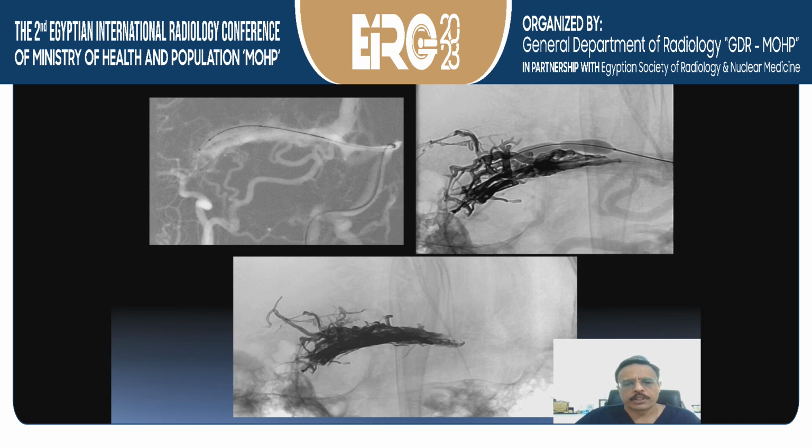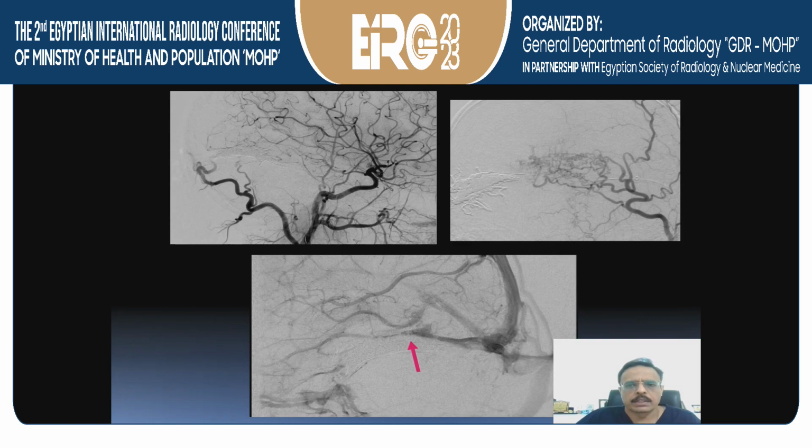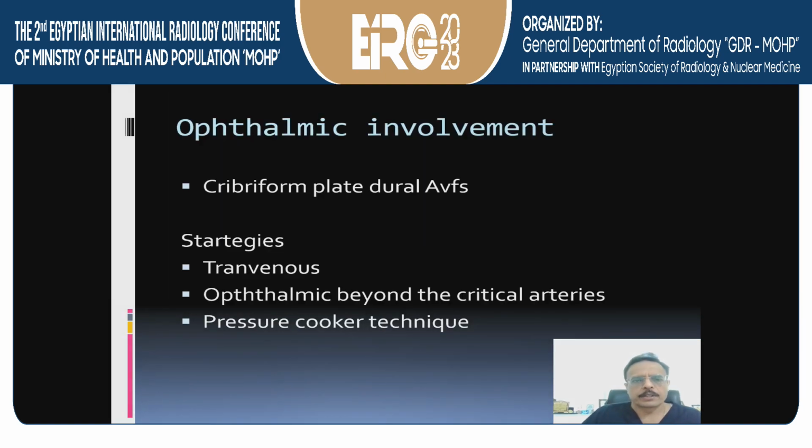But we knew the inflated balloon would preserve the junction of the vein and the sinus. In the final picture, it is all gone, but the arrow points to where the vein joins the sinus. That part has been spared by the balloon, and that is filling now normally.